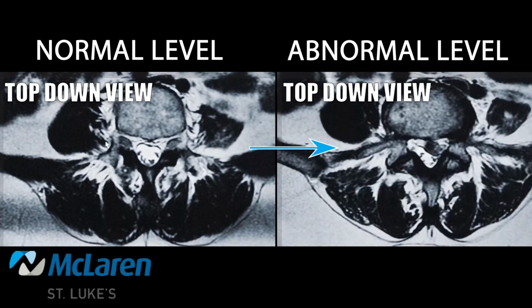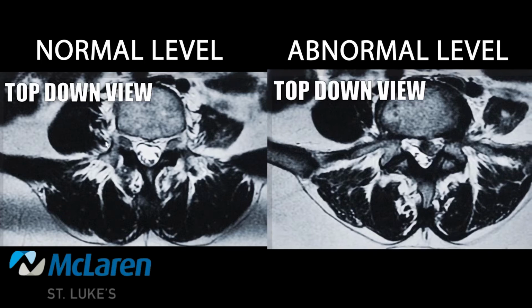If you come to the other slice just below that one, you can see the herniated disc right here, and that's a piece of disc material that has come out of the disc space and gone downward and tucked itself down under the nerve, pinching the nerve on this side, which again is the left. So most people who come in with a herniated disc with a pinched nerve, typically they'll present with symptoms with back pain, maybe pain or numbness into the butt, hip, or down the leg.